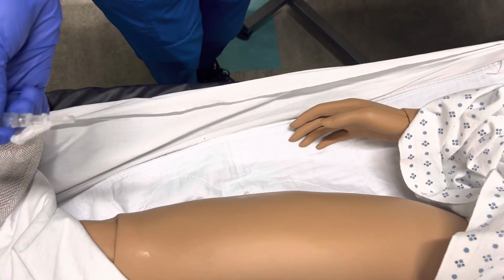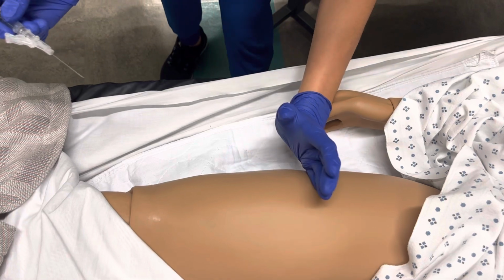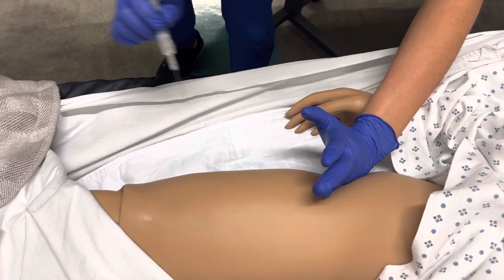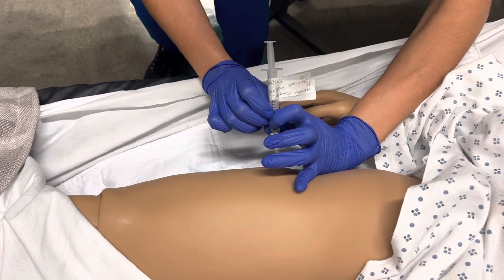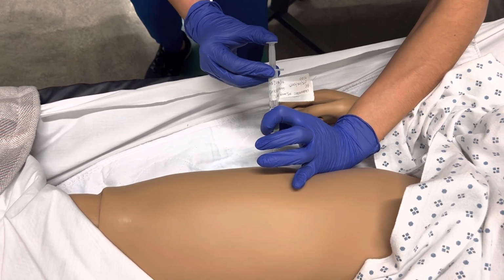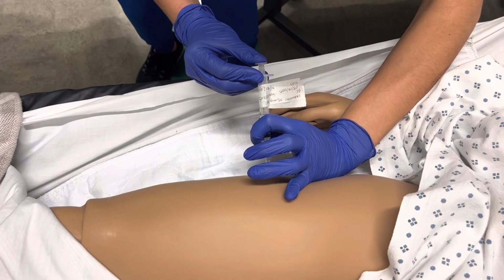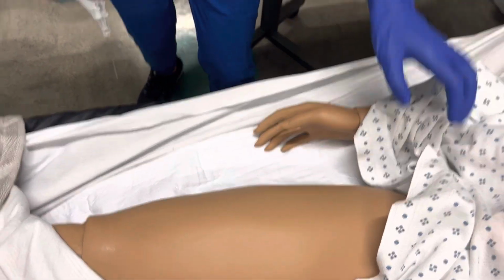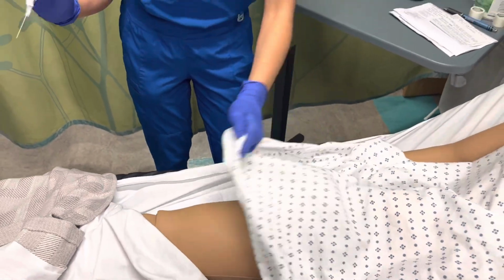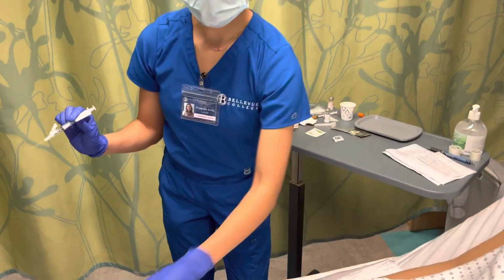And we're going to do the Z-track method. So I'm going to pull the skin and inject, stabilize, and inject our medication, pull out and release the skin. And I would safety this needle, but I'm going to recap it.